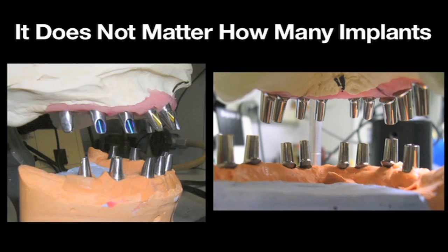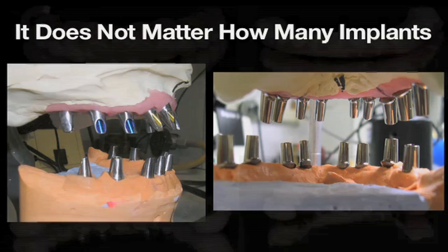When I'm doing large implant reconstructive cases, the question always becomes, well, how do you do that? Do you do that on 5 implants, 10 implants? And it really doesn't matter the number of implants. It's actually the positioning in a vertical dimension, and which abutments you select to maintain resistance and retention form of your prosthesis.